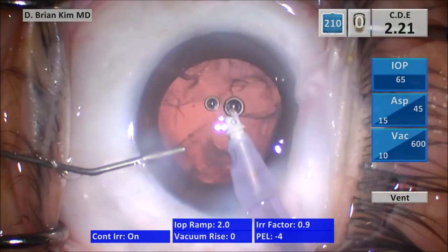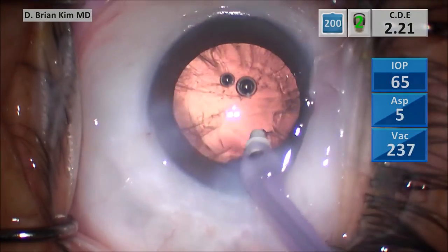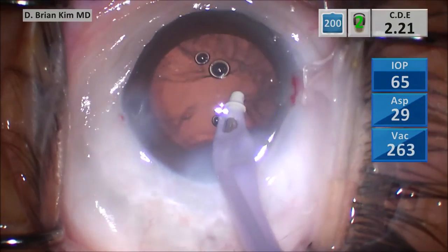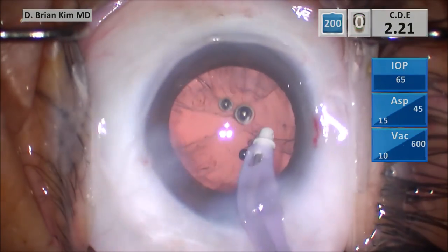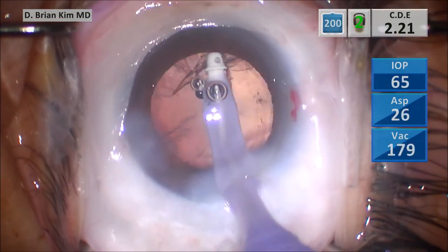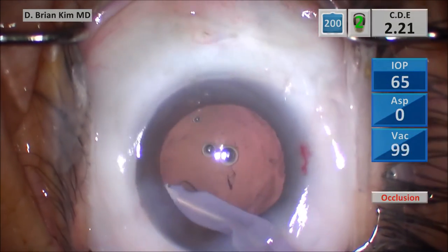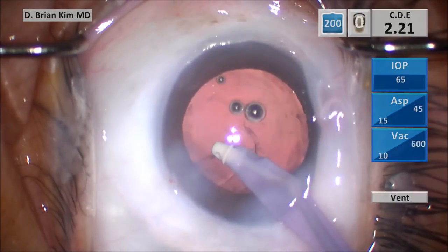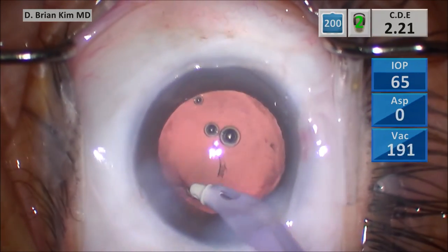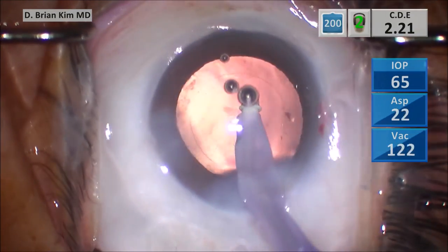With double chop and cross chop, you really don't need to use the phaco except as a fulcrum or as a chopping tool in the very beginning of lens disassembly. When you're dividing the lens and bisecting the right heminucleus, you're not using the phaco tip for ultrasonic energy or vacuum — you're just using it as a second chopper. That's why it's called double chop. Because of this, I've noticed that my cases are more consistent. I have had clearer corneas because of the mechanical fracturing, and my complication rate, although it was low before, has diminished as well.